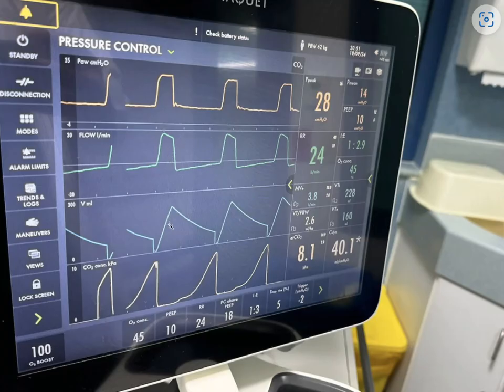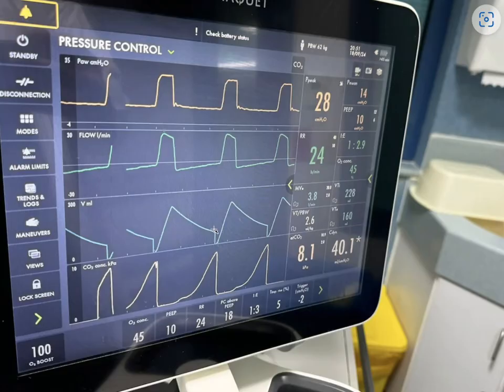Let's correlate this with the volume. Expiration starts here and the volume goes down. However, at end of expiration the lung is not completely emptied. The volume appears to go down to zero because the machine will recalibrate it before the next breath.